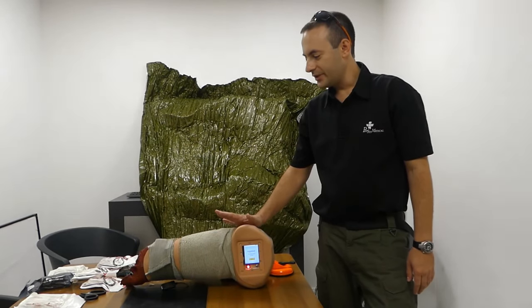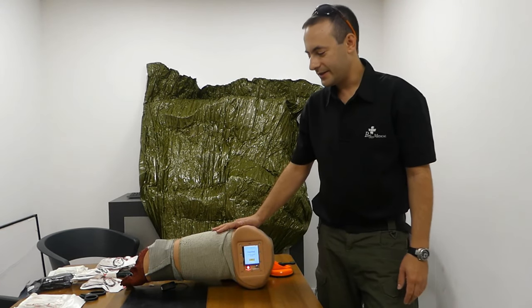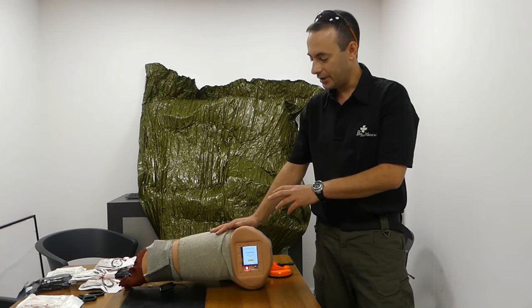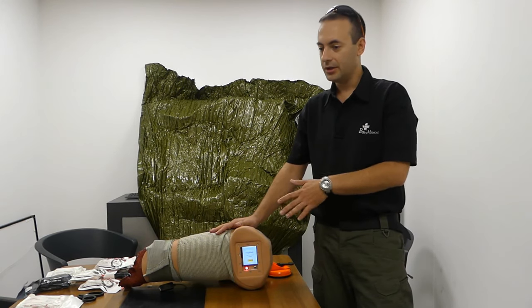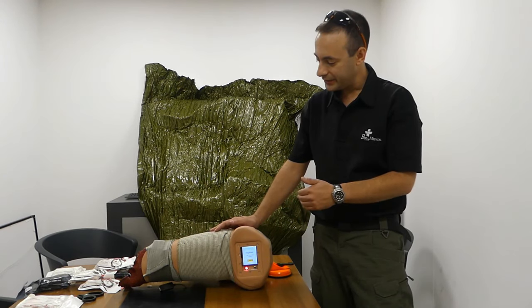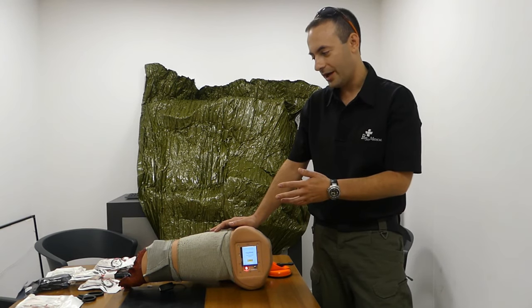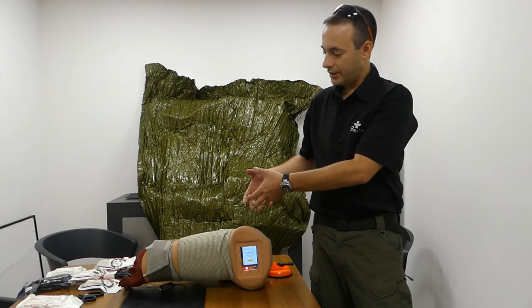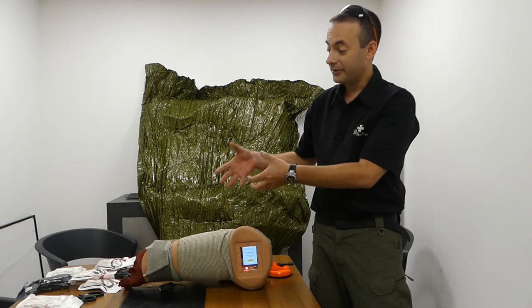We are using the Hapmed simulator as a pressure measurement tool. It's intended to measure pressure applied by tourniquets, not by bandages, but this is the only tool we have today to measure the pressure correctly on the circumference.